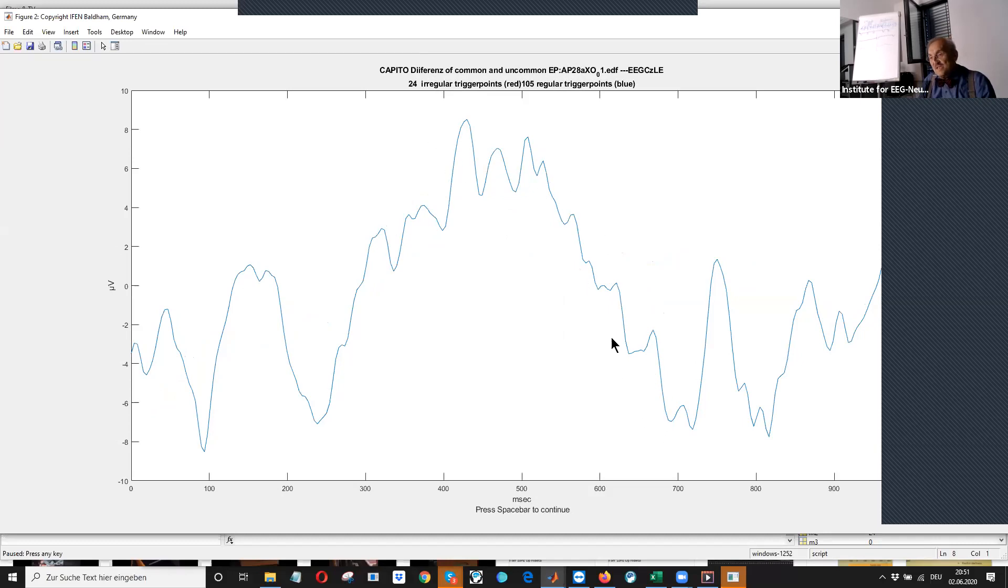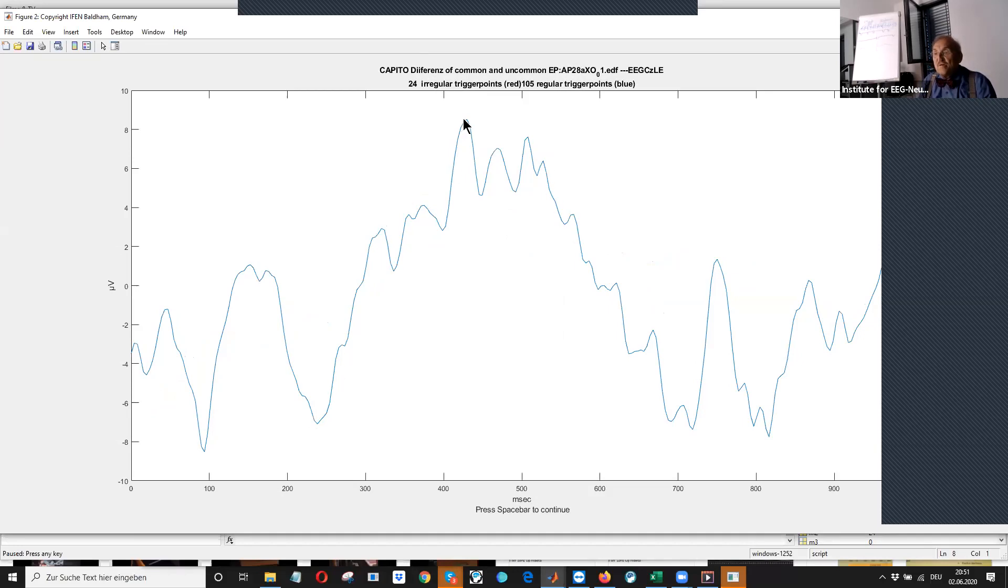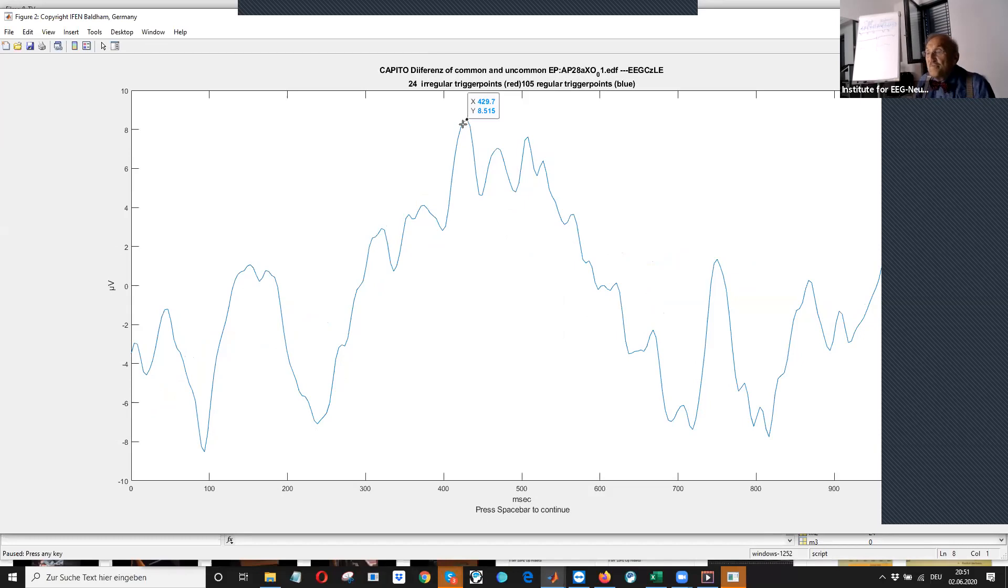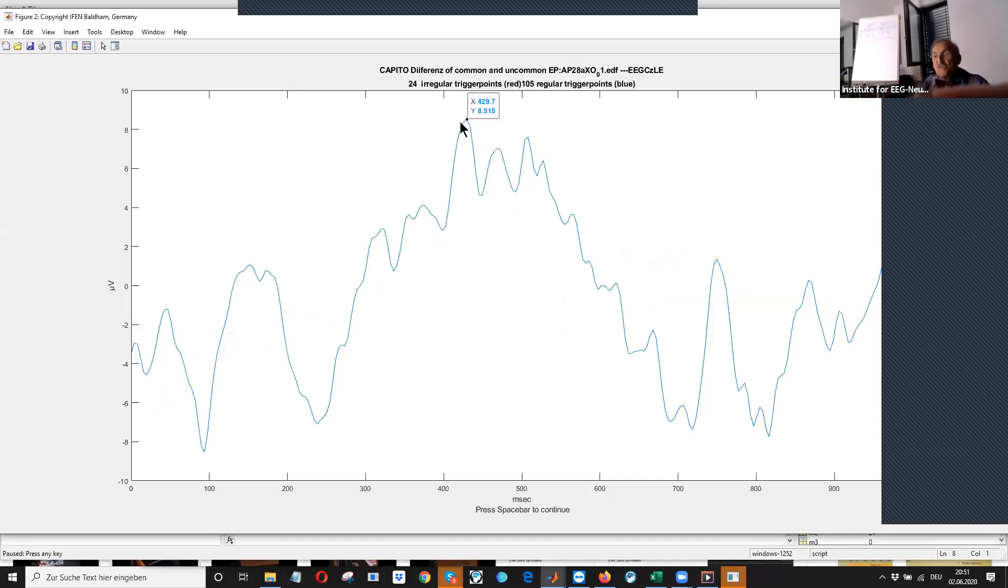I hope it's a little weak, the blue line, but that you can see. You can see that the maximum is, again, same 429 milliseconds, which is just in the normal range.